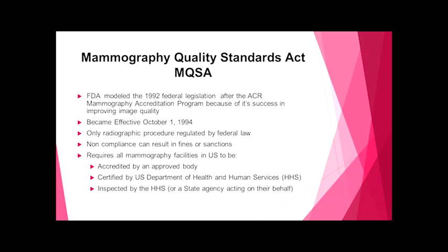The initial federal law became effective on October 1st of 1994, when all facilities performing mammography in the United States, accepting Medicare or Medicaid reimbursements, had to be accredited by a recognized entity.